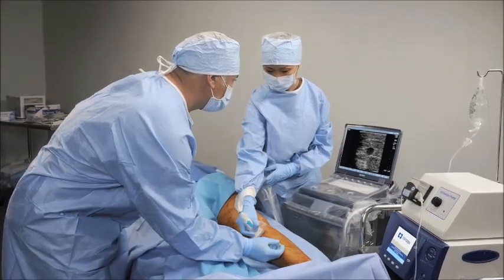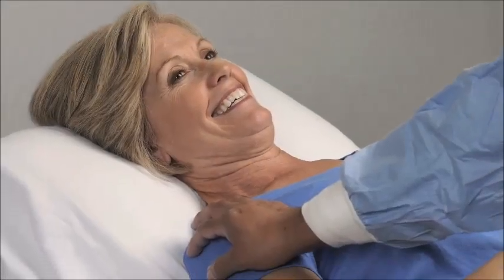The speed and precision of the benefit procedure offers patients a rapid and mild recovery, while providing doctors with a controlled and repeatable treatment experience.